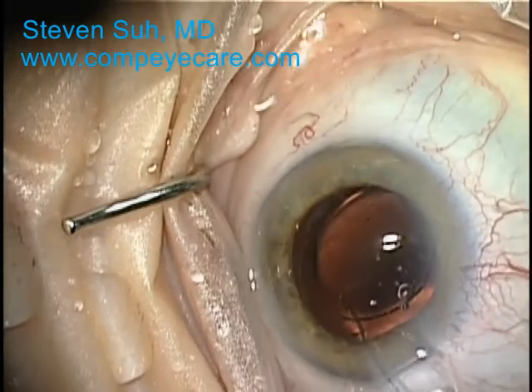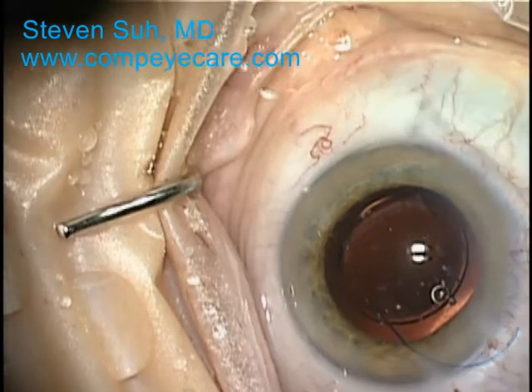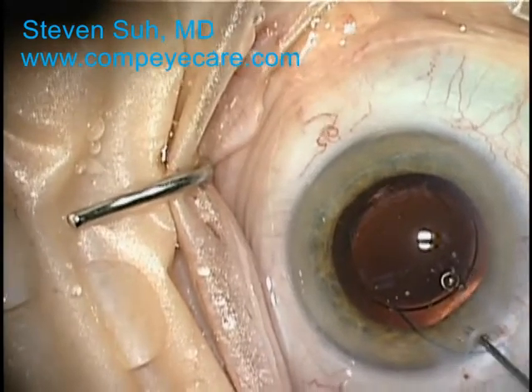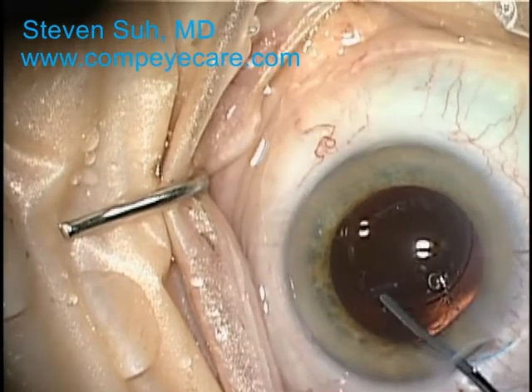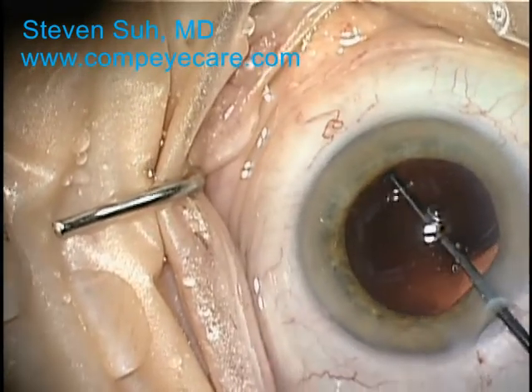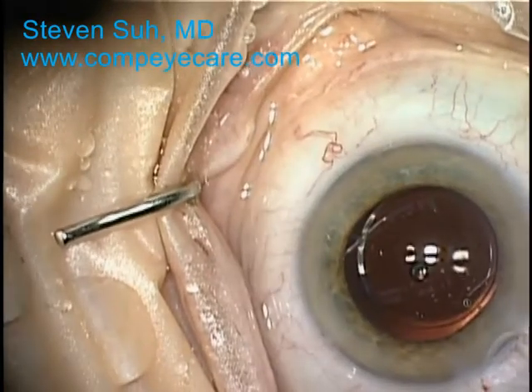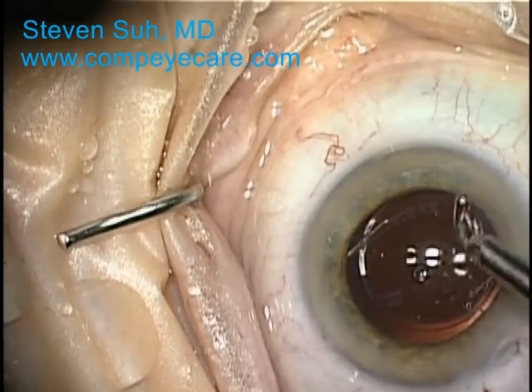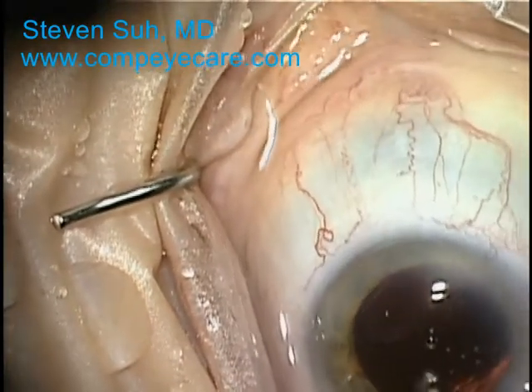There are 3 parts to this IOL: the 6mm silicone optic, which is the part that you see through, and the 2 fairly rigid blue curved haptics, which are the legs that keep the lens centered within the pupil. Acrylic is the other material commonly used in IOLs, and this metal instrument was used to place the trailing haptic into the capsular bag so that the IOL centers correctly.